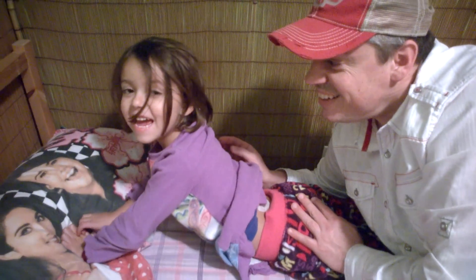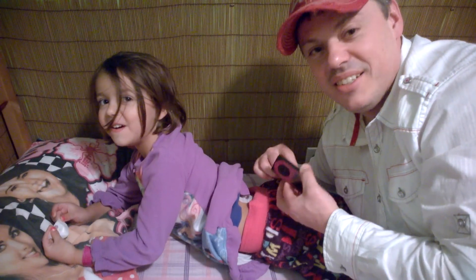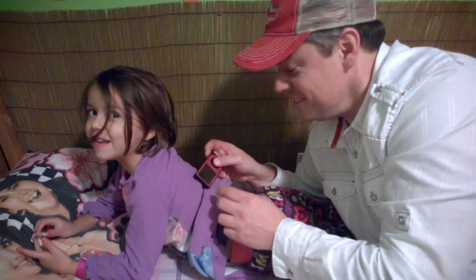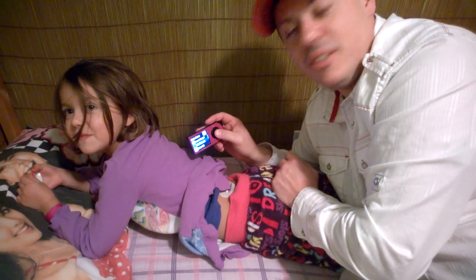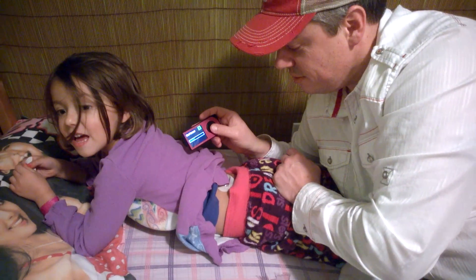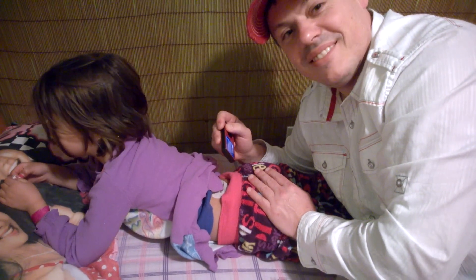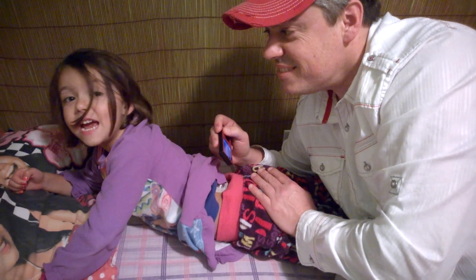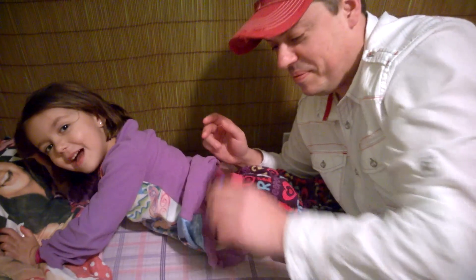What do you think? And that's it! I will be doing another video showing you my pump. Next time it will be my Omnipod — and that's called my pump. So now we'll start the sensor. Thank you. Bye-bye!